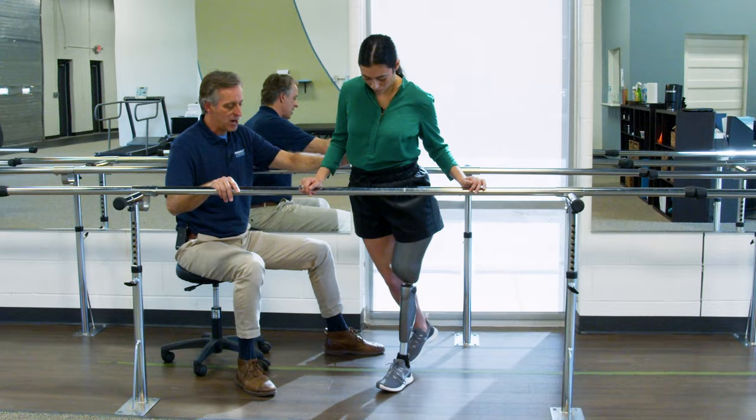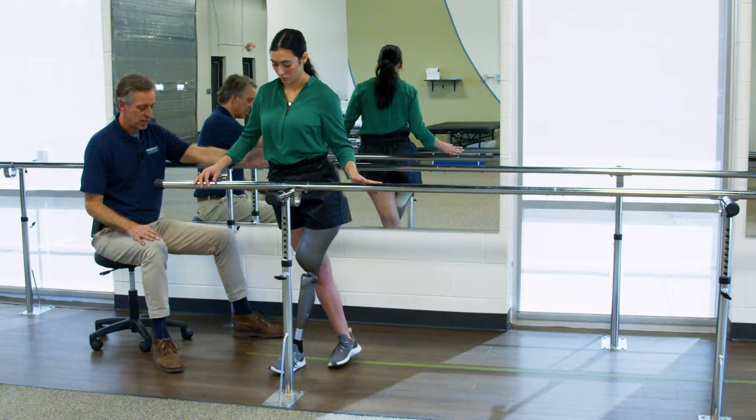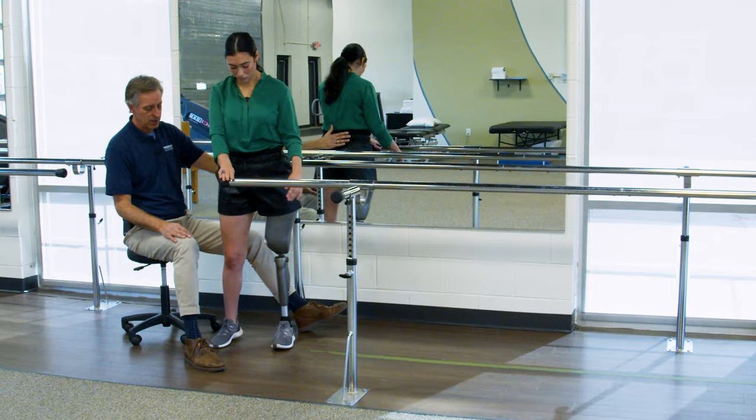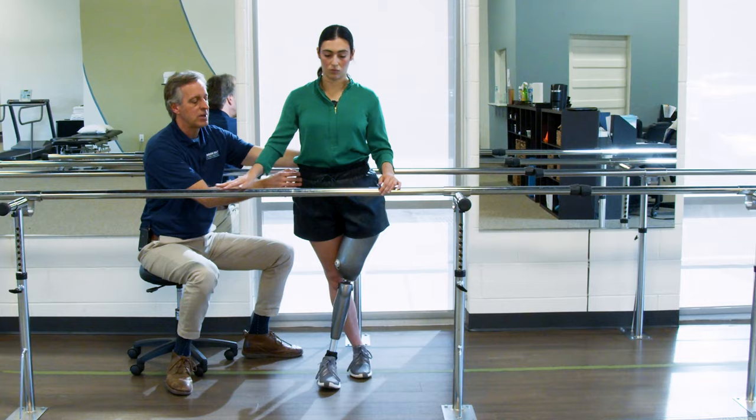Now step the prosthetic behind, step out, recapture a neutral position. Two more, there you go, good, and behind. Excellent, and going back the other direction. So just keep going, slowly moving those feet as best you can. Now if you keep your eyes at Tracy's pelvis, you're gonna notice that she really has to twist her hips and has to rotate to be able to take that step.